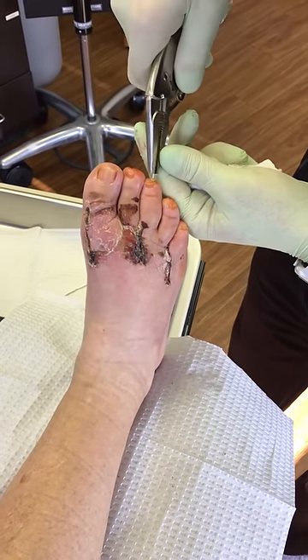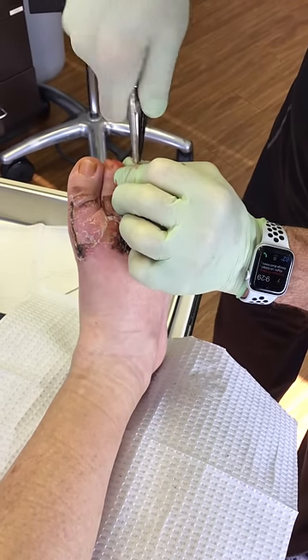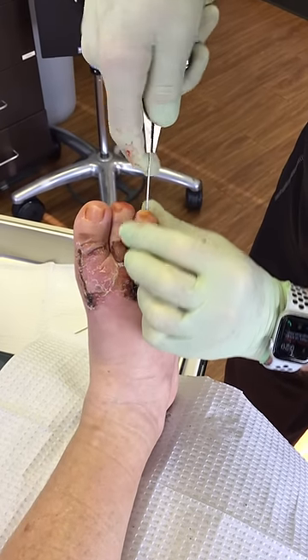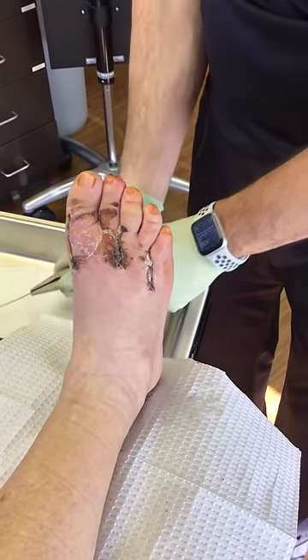Like I said, it feels stiff right in there. I don't know why. Here we go, okay, a little bit of pressure. Just breathe and relax for me. Breathe and relax. Here we go. It's like a reverse magic trick. Here we go. All done. And go on, thank you.